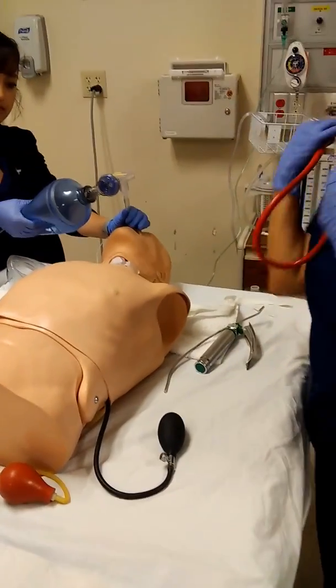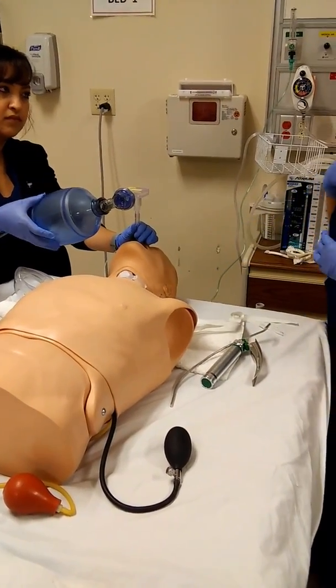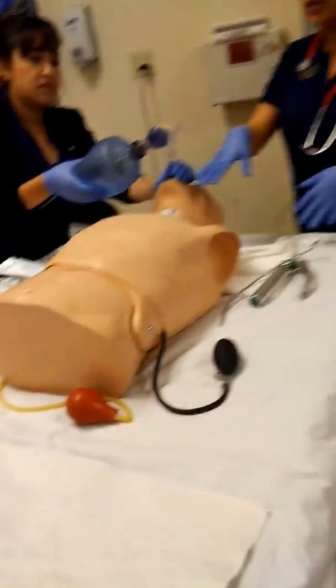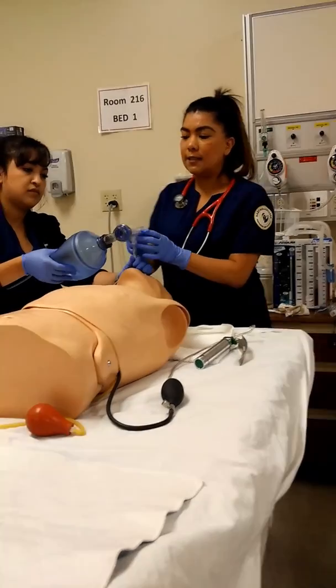When inserting the tube, we want to make sure that the tube is 3 to 5 centimeters above the carina. So what we would do is order a chest x-ray to confirm that. That's the proper way to confirm that the tube is 3 to 5 centimeters above the carina and placed correctly. We also look at the CO2 detector.